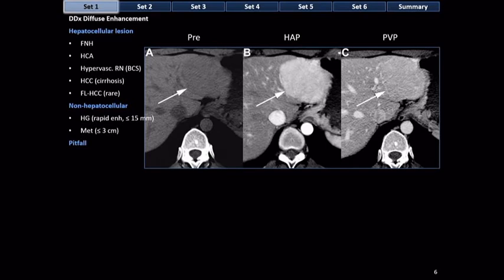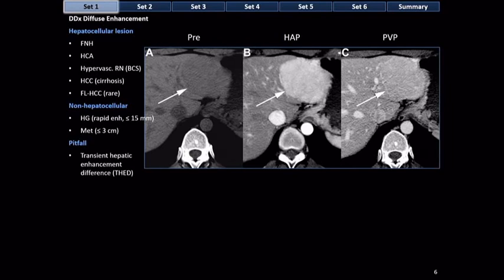As a pitfall, not everything that appears homogeneous is a mass. Occasionally we have perfusion abnormalities — so-called transient hepatic enhancement differences, or THEDs. This case is a real mass, so it's not a THED. It's way bigger than 15 millimeters or three centimeters, so it's not a hemangioma or a met — it's a hepatocellular lesion.